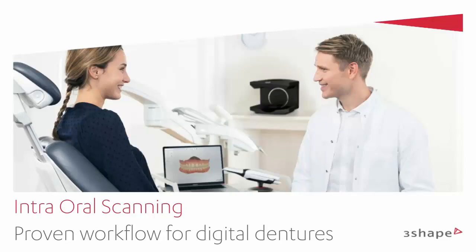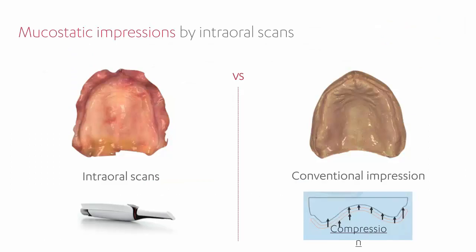And the question is more explored here by Lucio. So basically, in intraoral scans, you don't have any compression. You don't push on the gingiva. You are basically working on a non-touch. When you do a conventional impression, there's a lot of pressure going on. So there's a lot of compression going on.